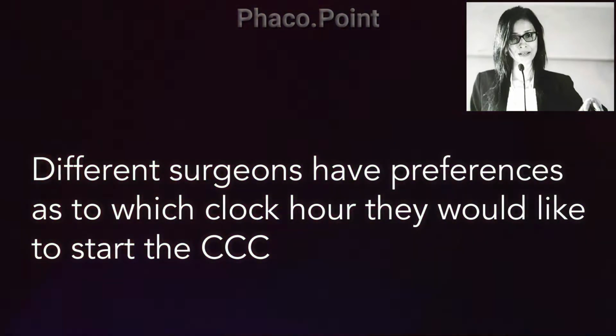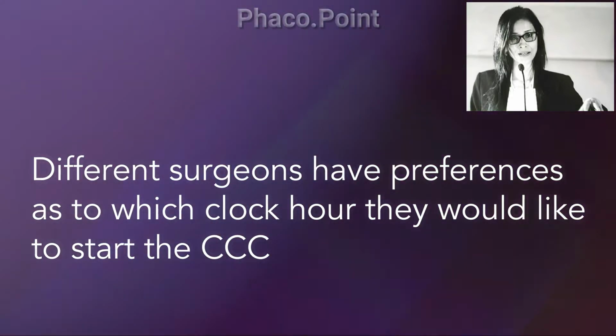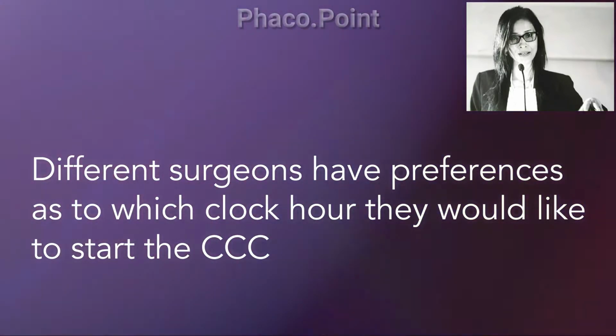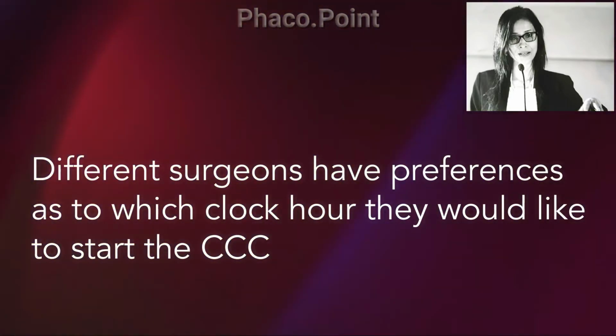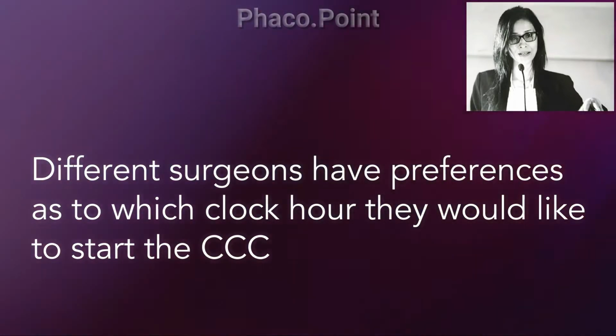And this may make it ergonomically rather challenging for the surgeon, who may now need to use either hand to be able to start, negotiate and control the tear to achieve a stable capsulorrhexis. And here are the final two considerations.